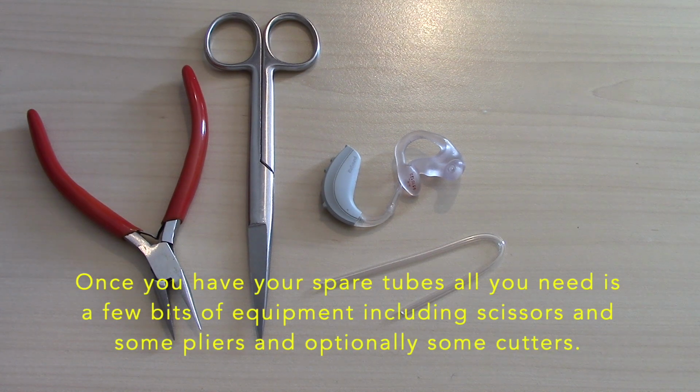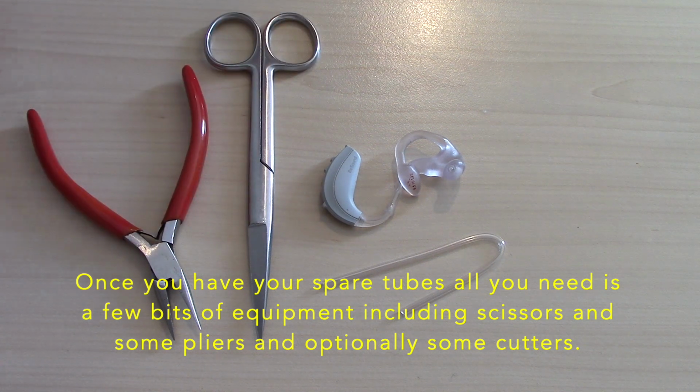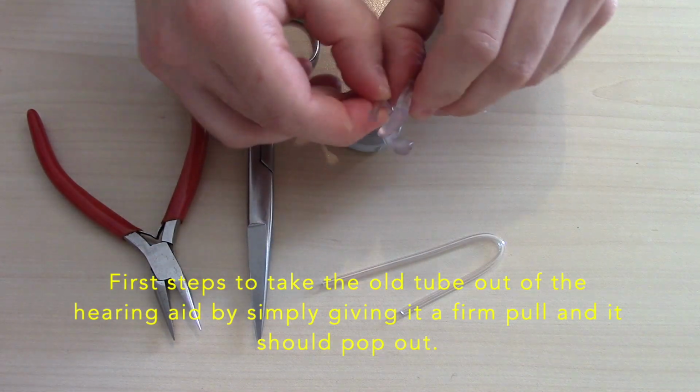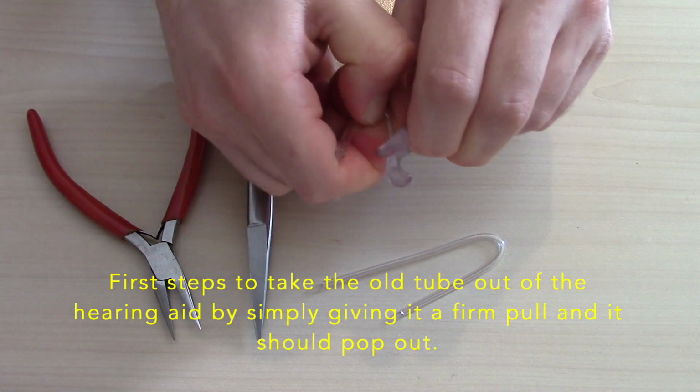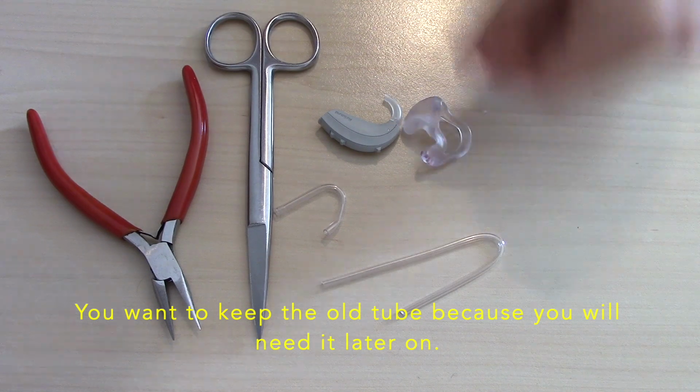Once you have your spare tubes, all you need is a few bits of basic equipment, including scissors, some pliers, and optionally some cutters. First step is to take the old tube out of the hearing aid by simply giving it a firm pull and it should pop out. You want to keep the old tube because you'll need this later on.